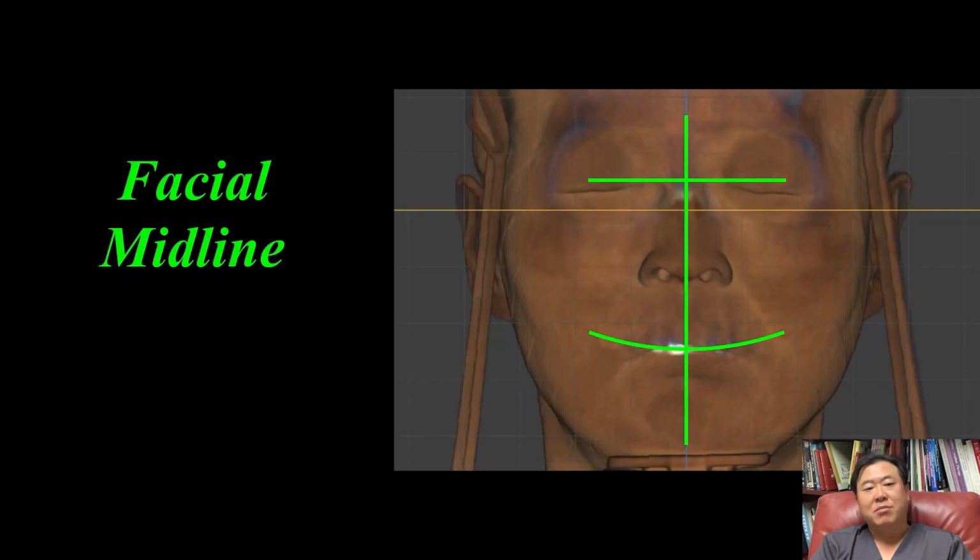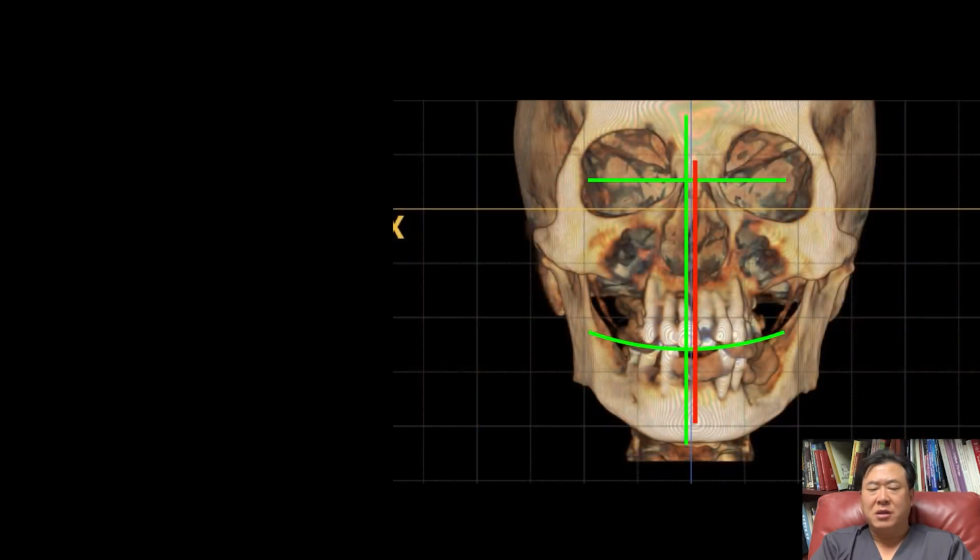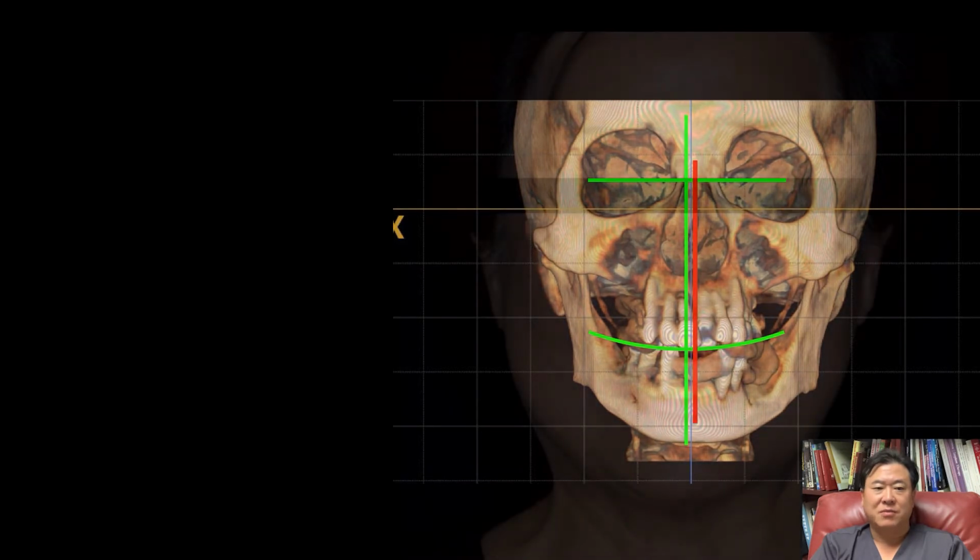When we try to find the midline, we cannot just rely on our visual perception with floss, ruler, or dentofacial analyzer. We have to be careful. Moreover, skeletal midline and facial midline do not always coincide. Actually, they usually deviate from one another. It's a tricky business. With a large FOV CBCT and a 3D facial scanner, we can come up with the most proper midline through the process called CBCT reorientation.